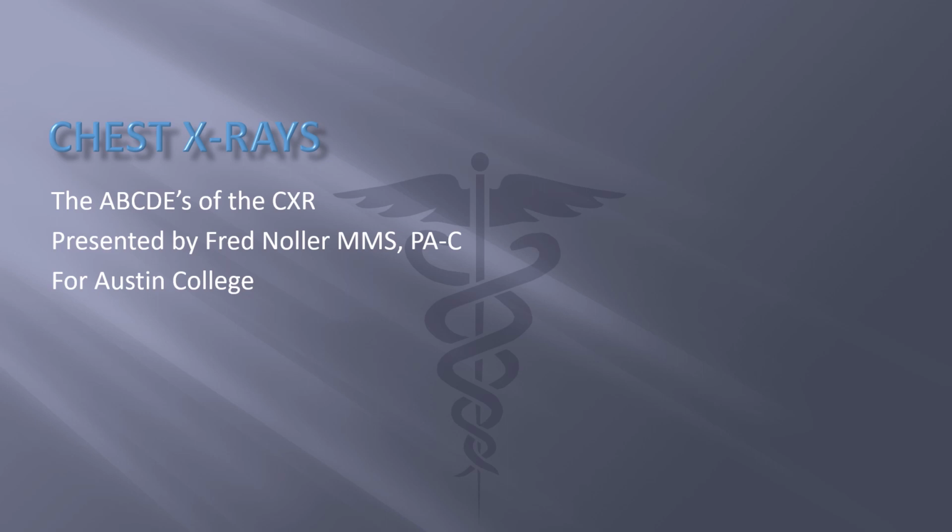I'm a PA and I work in critical care, and this is something that I use multiple times on a daily basis at work. I literally don't go a single day at work without looking at a handful of chest x-rays. So learning the fundamentals of reading a chest x-ray will really help your practice.